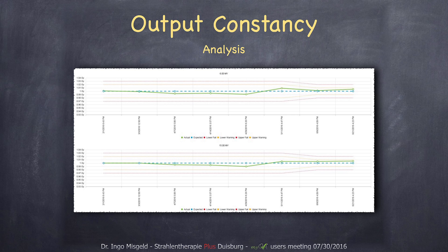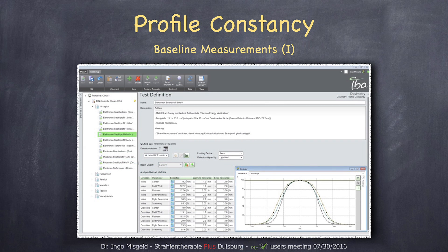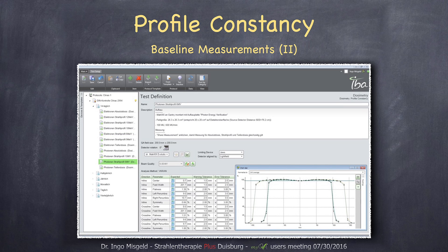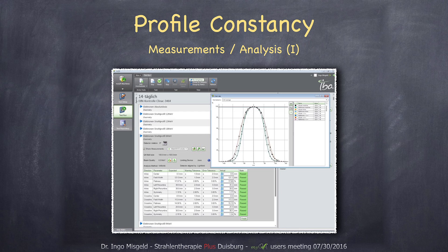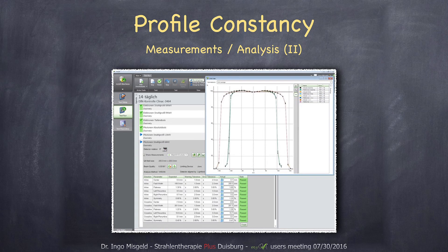The next point is the profile constancy task. Once again the baseline measurements have to be performed first. There you can already display your profile — there's a button you can press to directly see how your profile looks. This is for electrons. These are the photon profiles: inline, cross-line, and the diagonal profiles. The measurement works the same way, and you have the pass and failed status for every parameter. You can also display your profile right after the measurement.